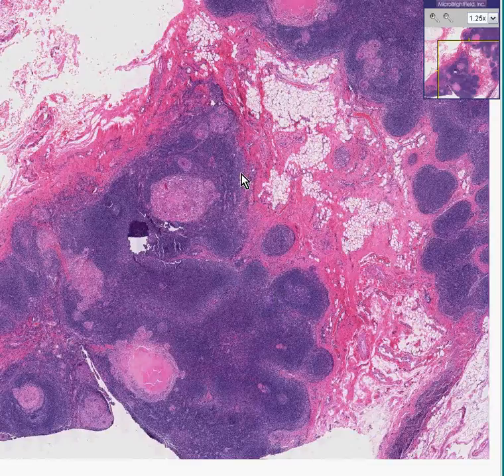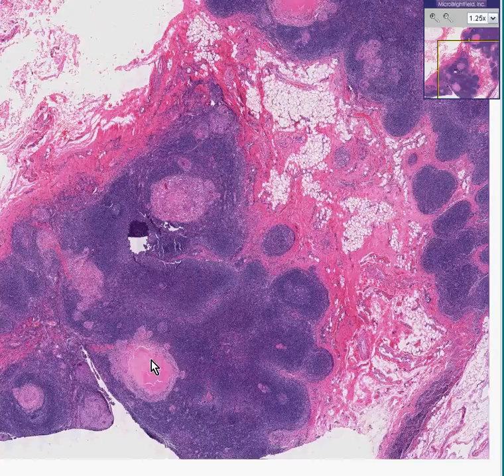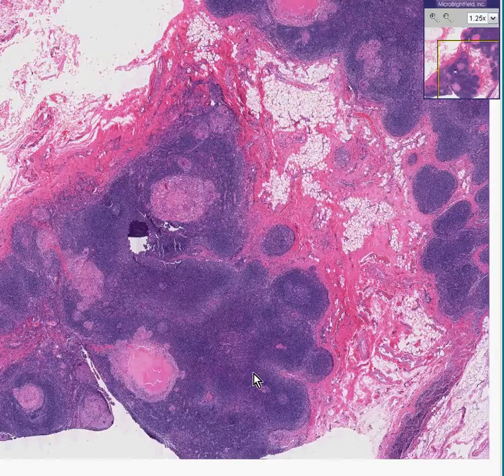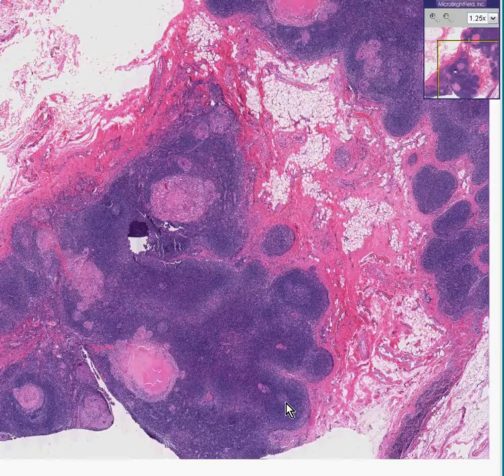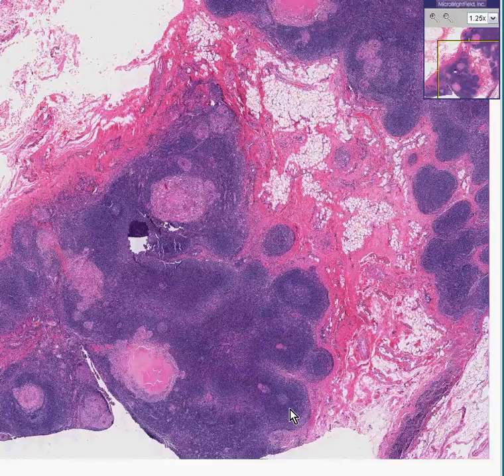In addition, you could see something else in this lymph node which doesn't look right — perhaps here and here and here and here. Whereas in a normal secondary follicle, you have a lighter germinal center surrounded by darker lymphocytes.